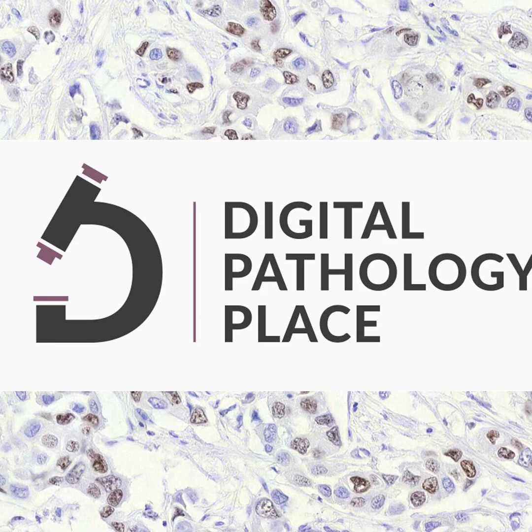And I mean, everyone who works in the field, you as well, knows that tissue has an incredible heterogeneity. It can come from different parts of the body. If you do translational work, even from different species, you can have different indications, and this can create huge variability in tissue organization, morphologies or cellular morphologies, densely packed, very sparse. And this can create a lot of difficulty if you want to describe this with automated methods.